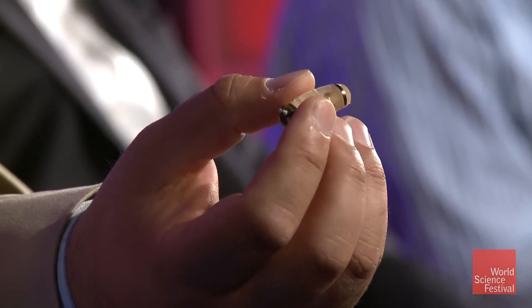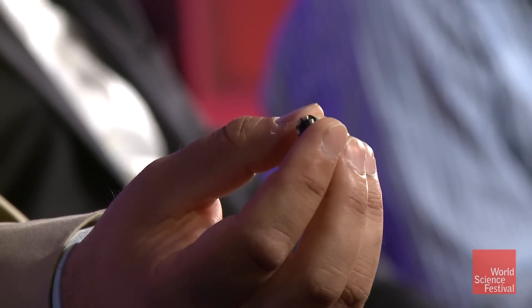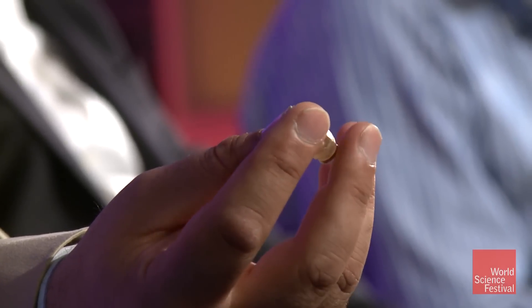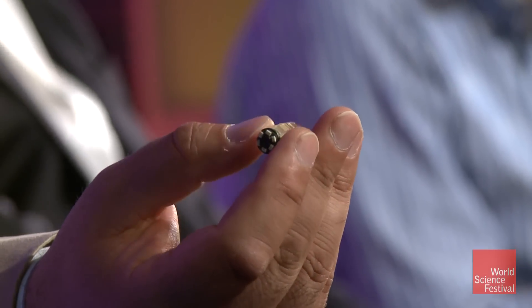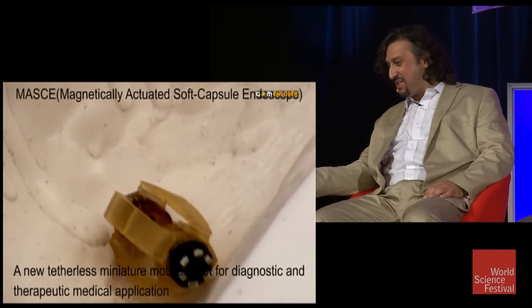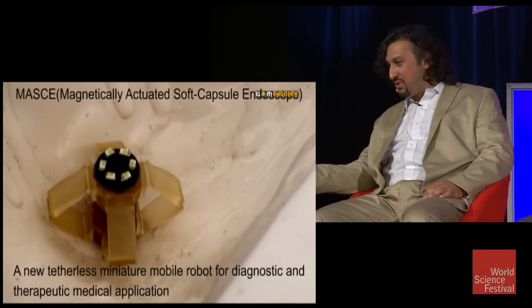So it can roll inside your stomach, it can be stopped, it can go backward and forward as a robot. How would you put it in? You swallow it — it's a pill size. This is a completely wireless robot, as you see in the video.